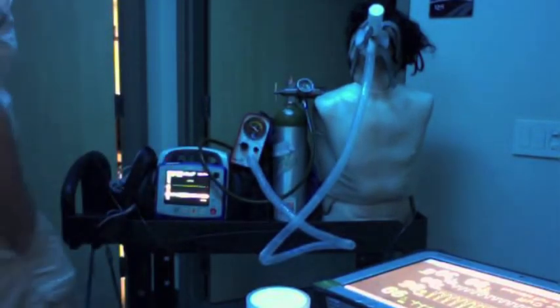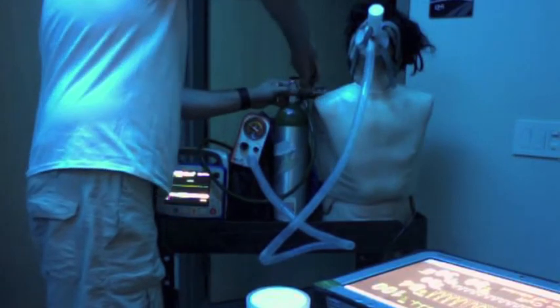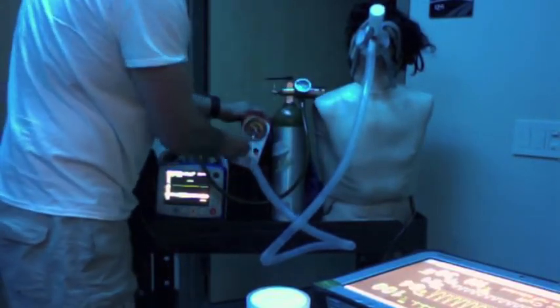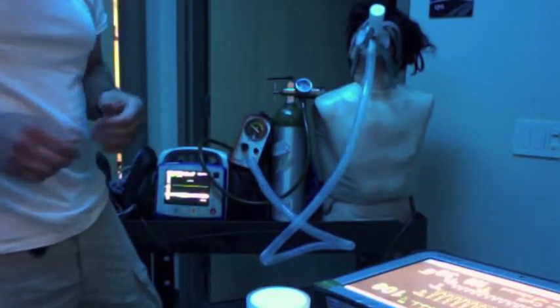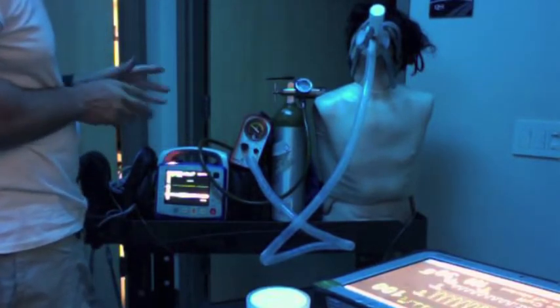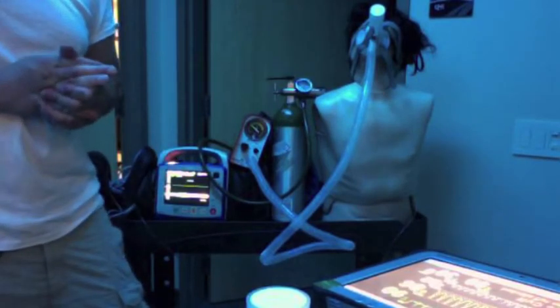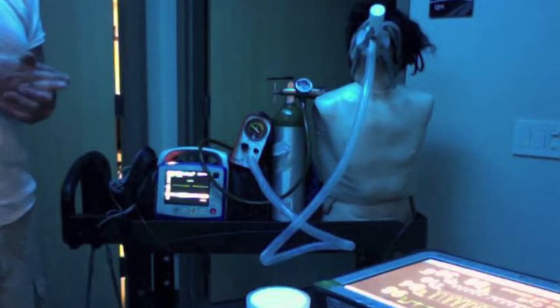And then we'll turn it on. It is quite loud most of the time, and of course it's not that loud right now because our patient isn't breathing, but it is nearly impossible to verbally communicate with your patient when this is on.